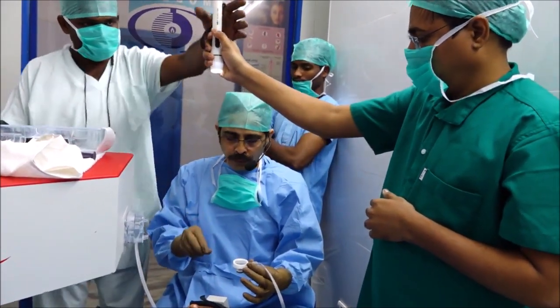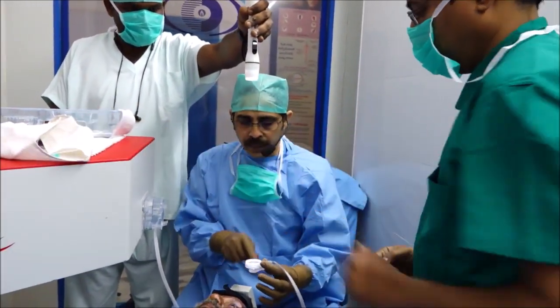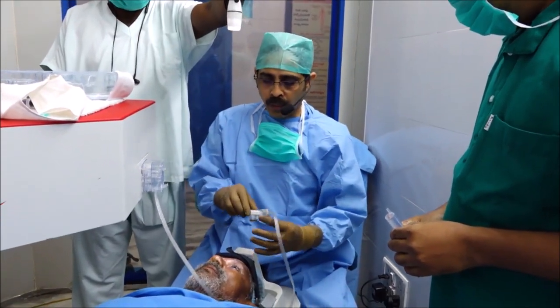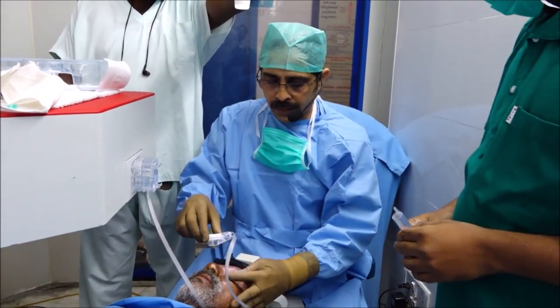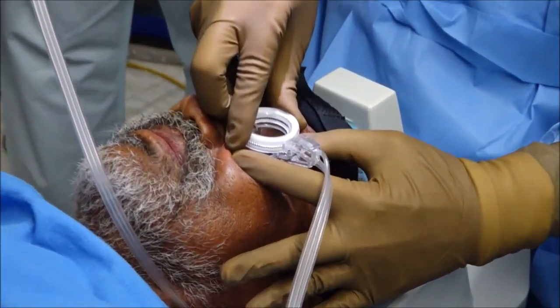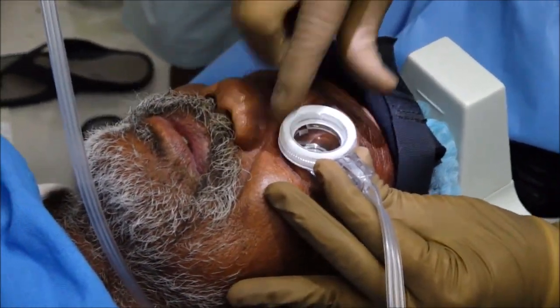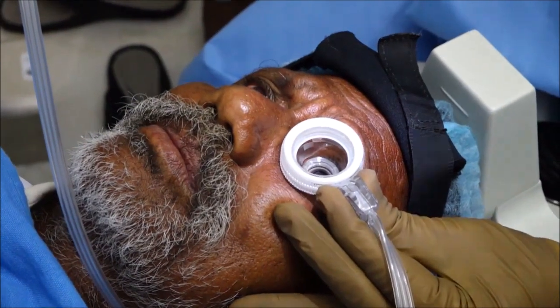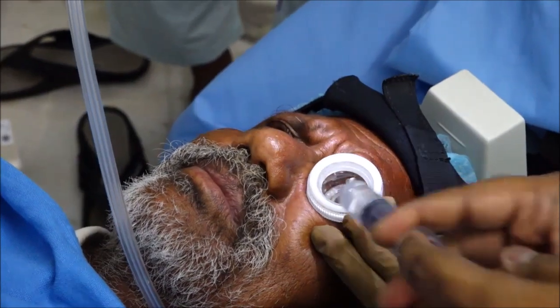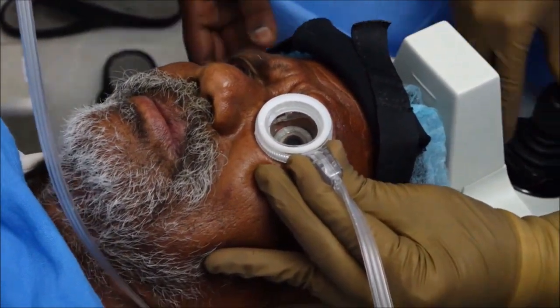Whenever you give a block, there will be conjunctival chemosis and swelling. Whenever there is conjunctival swelling, the liquid optic interface cannot be held properly on the conjunctiva. So now we just retract the eyelids a little bit and keep the liquid optic interface onto the eyeball. Press it a little tight, then switch the vacuum on. The 12 mm suction ring holds the conjunctiva with a little bit of vacuum.